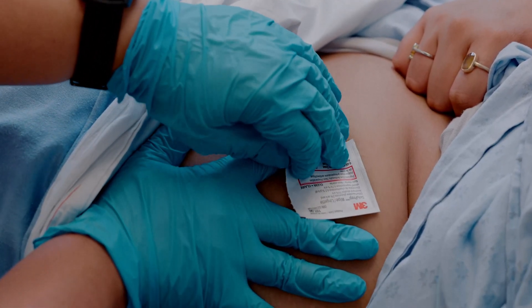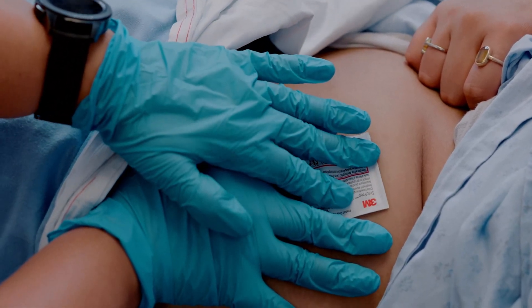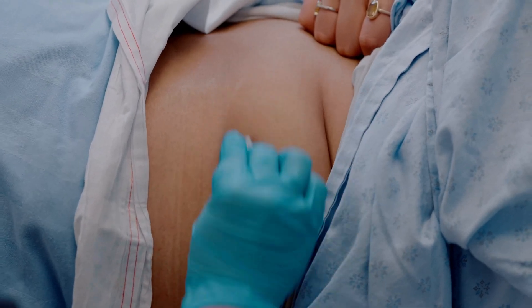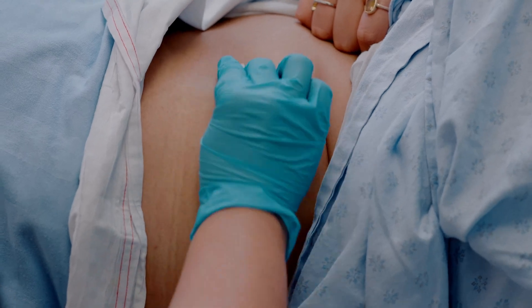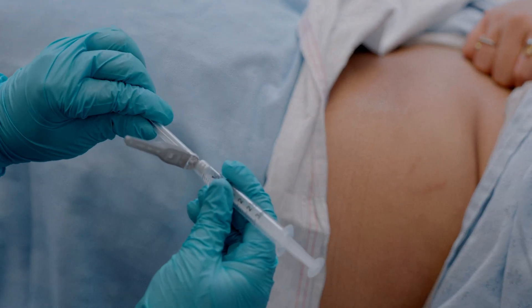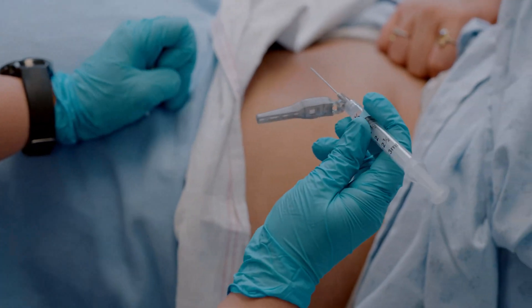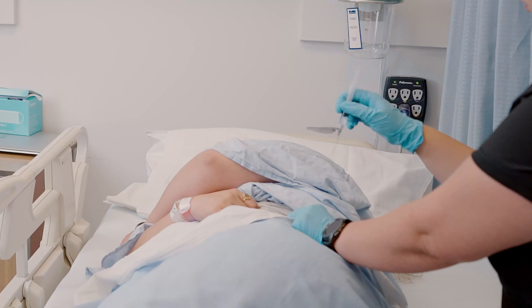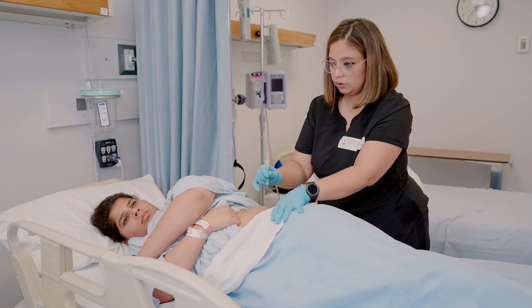Once you have located the site, it may help to mark it with an unopened alcohol wipe. To clean the injection site, go in a zigzag manner for 30 seconds. Once the area is dry, remove the needle cap and hold the syringe with the thumb and forefinger of your dominant hand as if it were a dart. Remind your patient to try and relax.